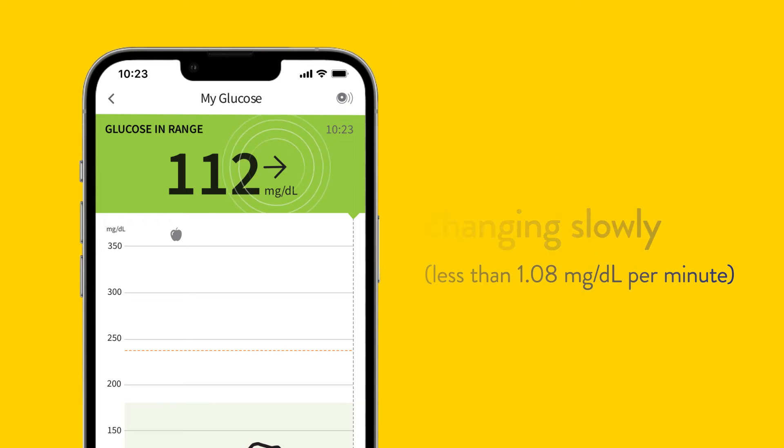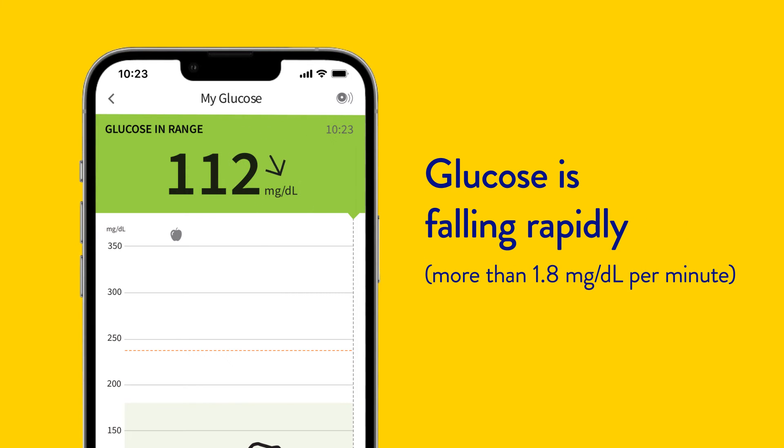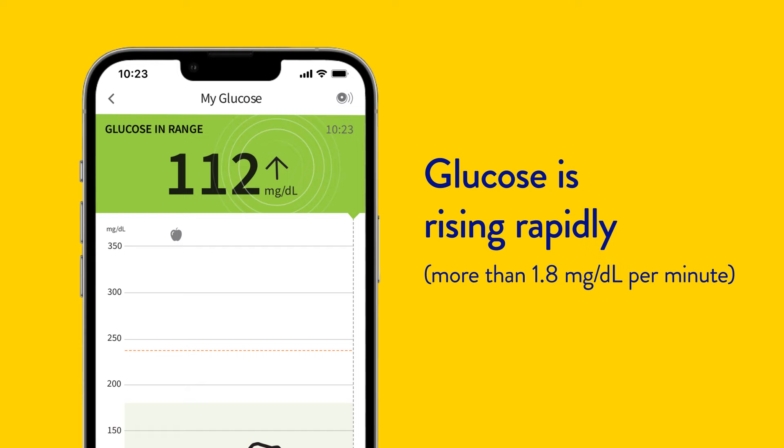Changing slowly, rising, falling, falling quickly and rising quickly — allowing you to act instead of react.